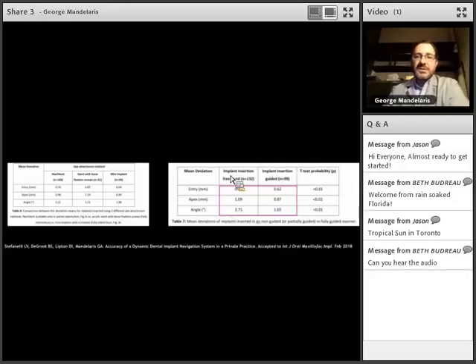0.77 millimeters versus 0.62 millimeters. What did happen is the implants were placed a little deeper than when they were placed using dynamic navigation. Again, you're talking 0.2 millimeters. That's even difficult to measure. And the angle discrepancies were also not quite as favorable as when we followed the plan using navigation from start to finish.